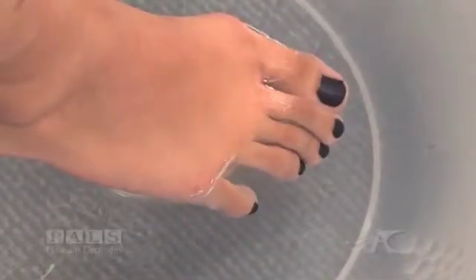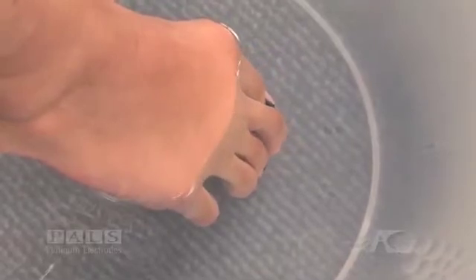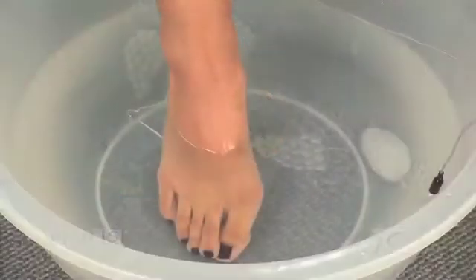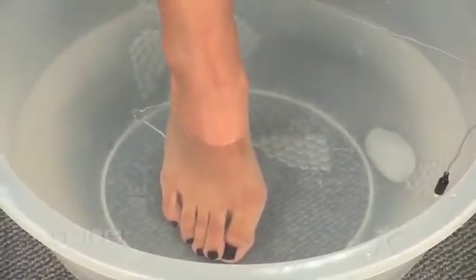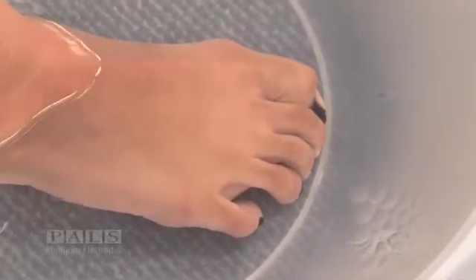When only the toes are in the water, intrinsic toe flexion can be seen. As the foot is submerged further into the water, activation of toe flexors as well as the muscles of the arch of the foot can be seen.